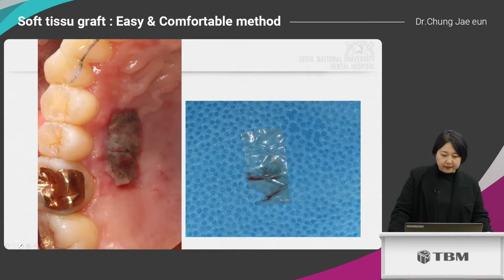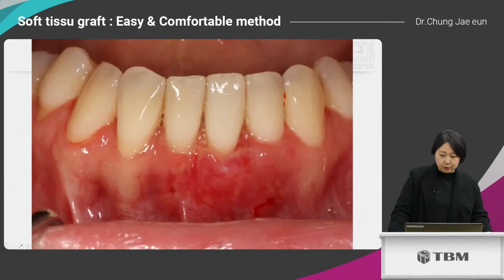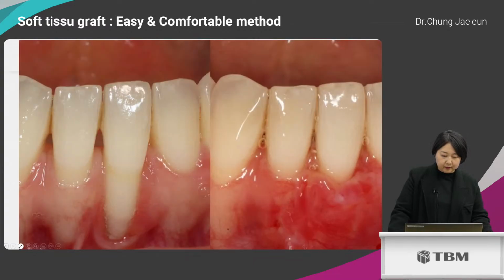After removing the dressing, the wound site showed a good healing state. This is about 2 weeks after the surgery. Compare with the pre-surgical state, SCTG was successfully done.